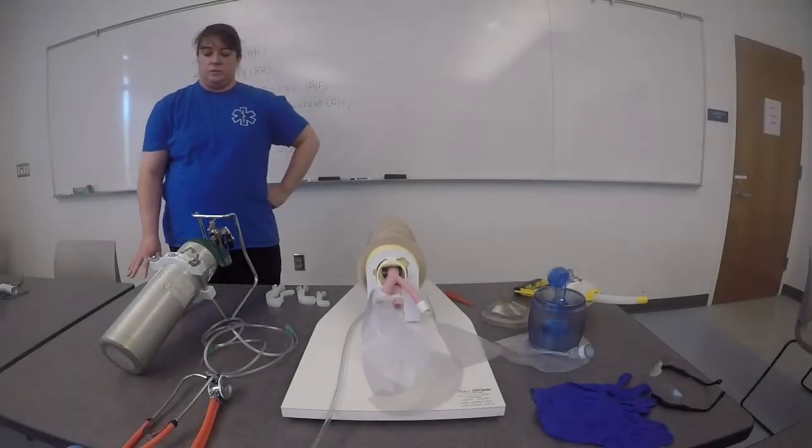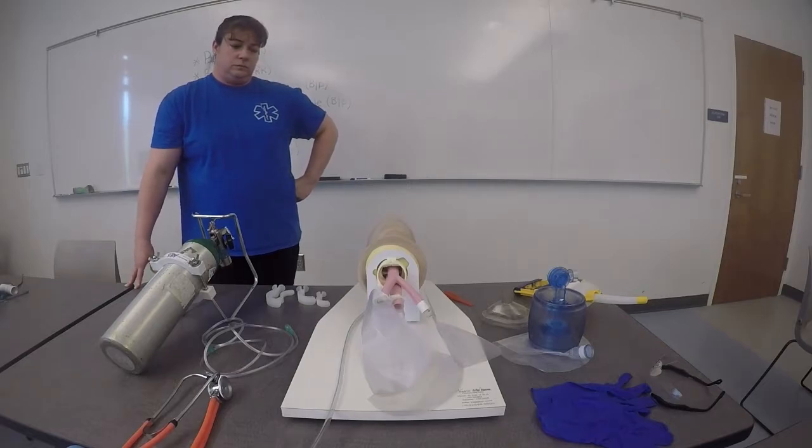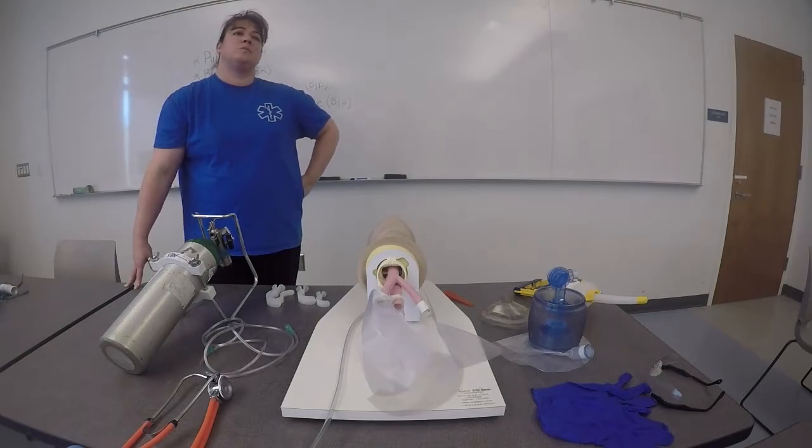This is bag valve mask ventilation of an apneic adult patient. This skill is designed to evaluate your ability to provide immediate and aggressive ventilatory assistance to an apneic adult patient who has no other associated injuries. This is a non-trauma situation and cervical precautions are not necessary. You are required to demonstrate sequentially all procedures you would perform, from simple maneuvers, suctioning, adjuncts and ventilation with BVM. You must actually ventilate the mannequin for at least one minute with each adjunct and procedure utilized. I will serve as your trained assistant and will be interacting with you throughout this skill. I will correctly carry out your orders upon your direction. Do you have any questions?